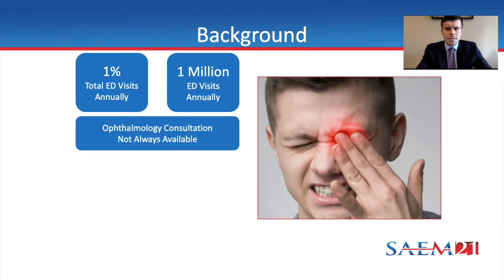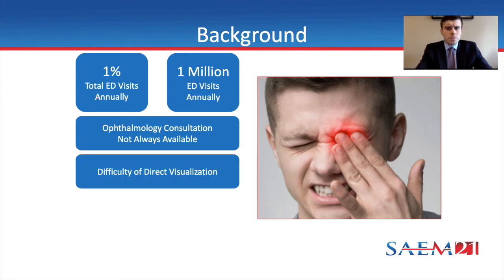ED providers need to be able to assess patients with ocular complaints, particularly as ophthalmologic consultation is not immediately available in all settings, which can potentially lead to misdiagnosis and treatment delays. Direct visualization of intraocular structures is difficult or impossible when the eyelids are swollen shut after injury. In addition, fundoscopic examination is operator dependent, with training and available tools playing an important role in its clinical utility.